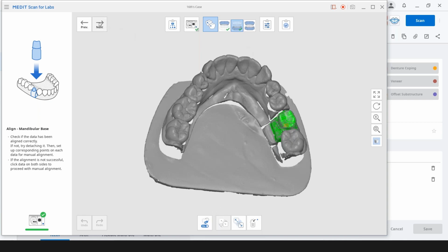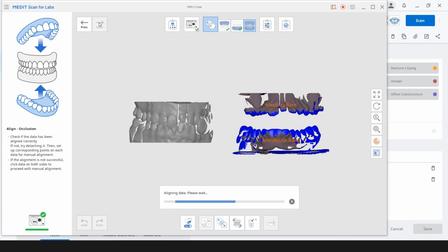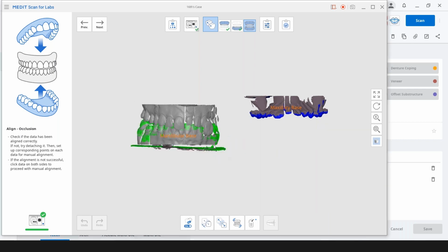All right, and then we're gonna do the same thing with the models. This didn't come out very well. They should be all blue there because I probably didn't trim it right. Of course, all the cases I did before this lined up just perfectly. But it's always the way it goes with live webinars.